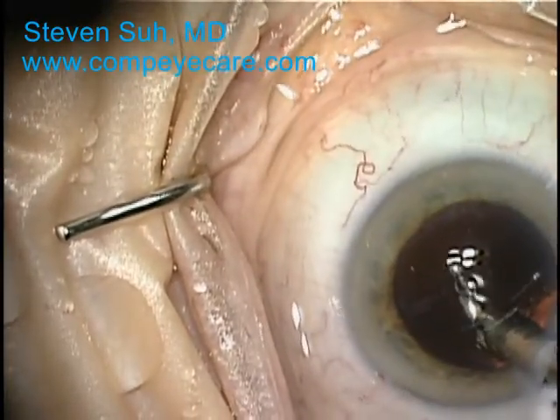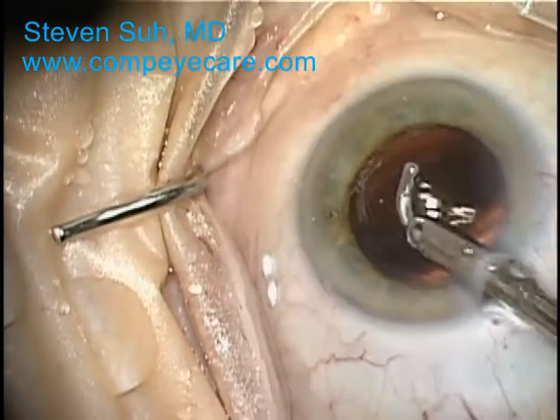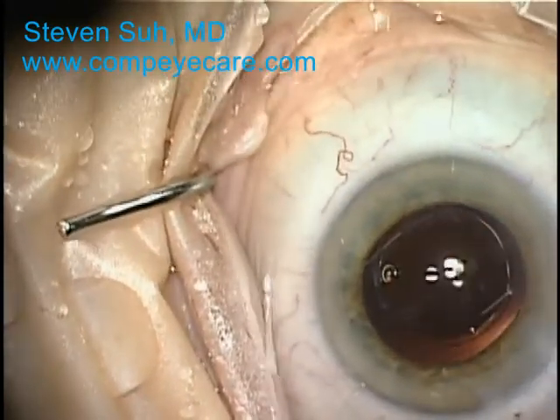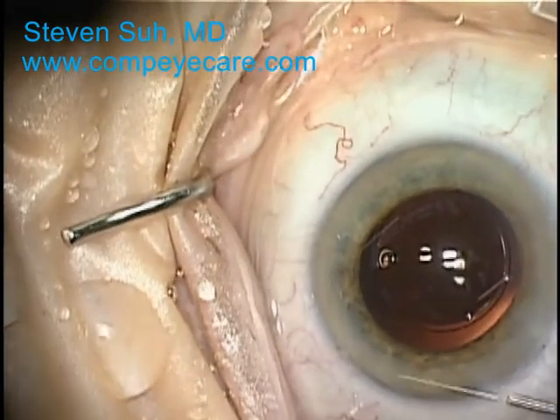It's necessary to use the I/A instrument again to remove the remaining viscoelastic substance because it does not get cleared easily by the natural drainage system of the eye. If too much of this viscous material remains, then there may be high elevations of the eye pressure postoperatively.